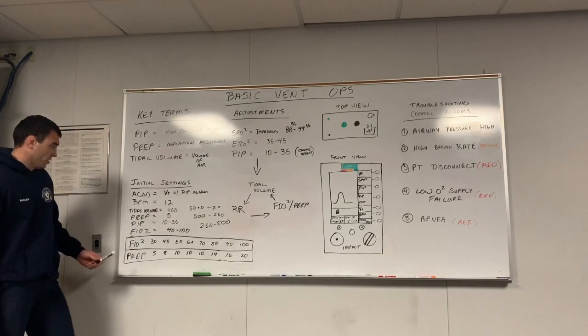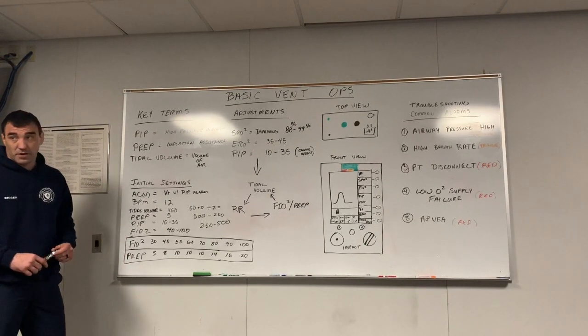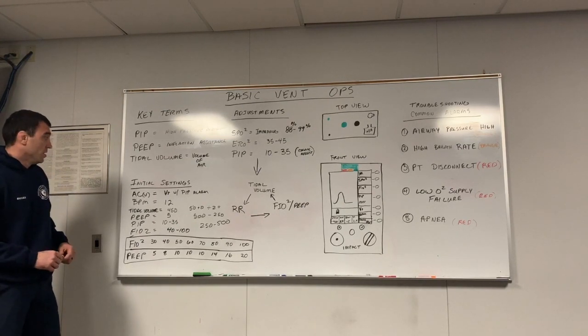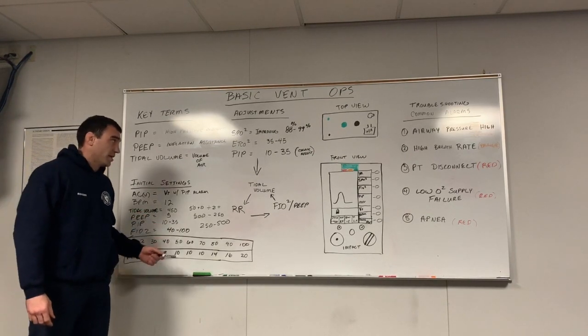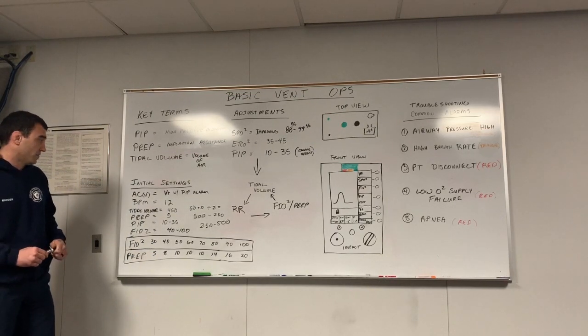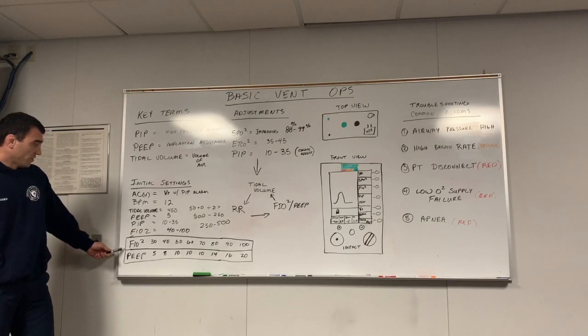If you look at the chart here, to think about PEEP, if we're having to give somebody 100% concentration of oxygen, we need to increase our PEEP. What most people will try to do is leave the tidal volume very high, use a high level of concentration of oxygen, and it leads to alarms on the vent because you're giving the person too much oxygen. There's not enough room, or too much volume of air. Okay. So this is a chart here.